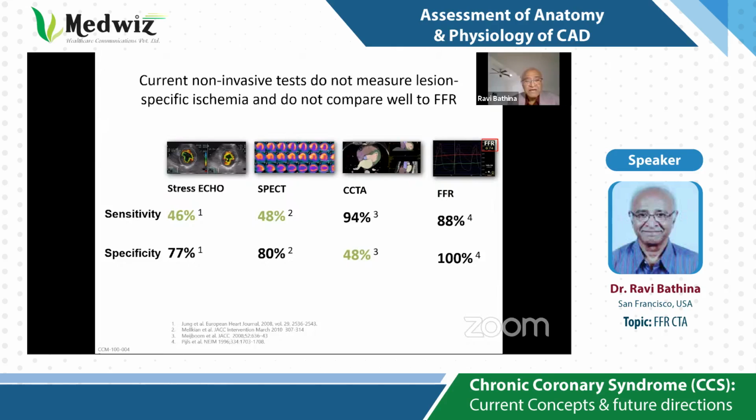But because there are limitations in the temporal and also the spatial resolutions, their sensitivity and specificity are suboptimal. So at this point of time, we are stuck with, if you can see the screen to my extreme right, invasive FFR, which has better sensitivity and specificity.